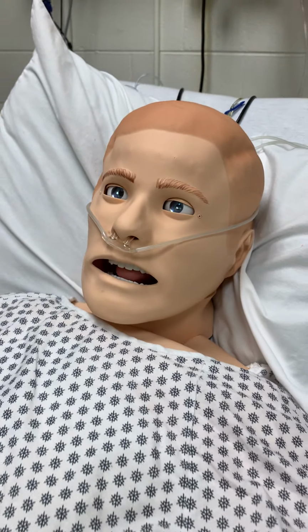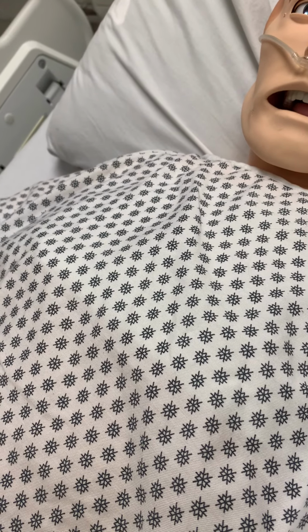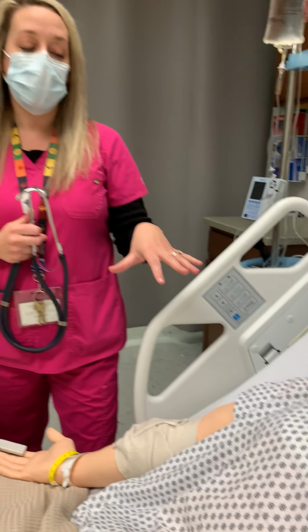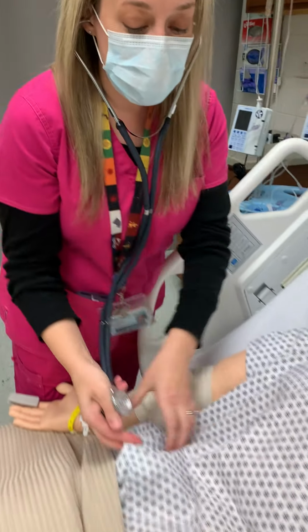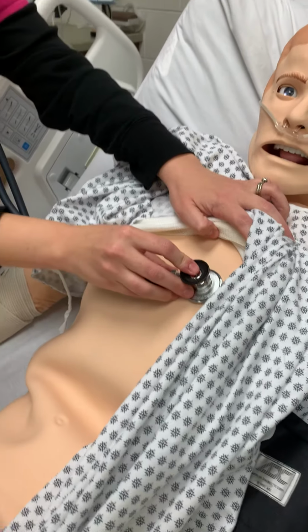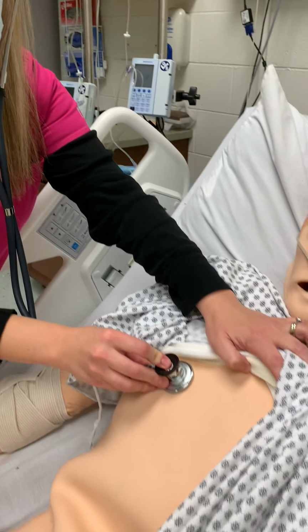I don't know if you can pick up on it on the camera, but his chest rises and falls just like he was breathing like a real person. Another cool feature that we have with the mannequins is that the students can come over and assess him by listening to his heartbeat. He has a heartbeat, he has respiration sounds, I can give him all kinds of different lung sounds. He has bowel sounds that they can use that stethoscope for. So they'll do it just like a real nurse and a real patient. So students are getting a very practical, very hands-on experience in the healthcare programs here at VHCC.